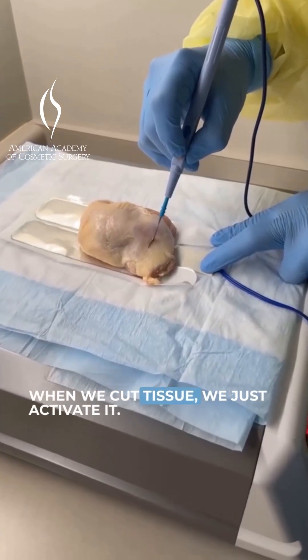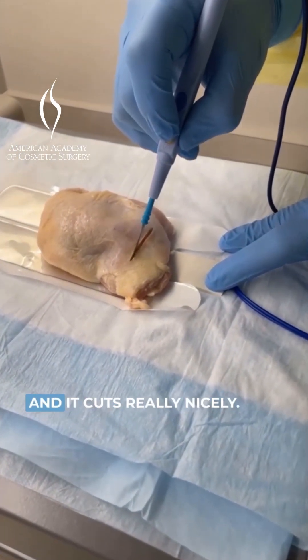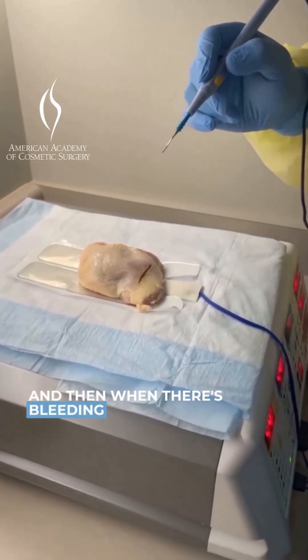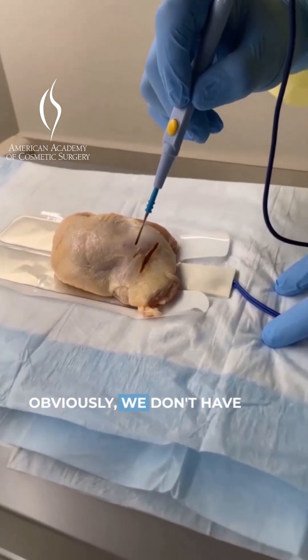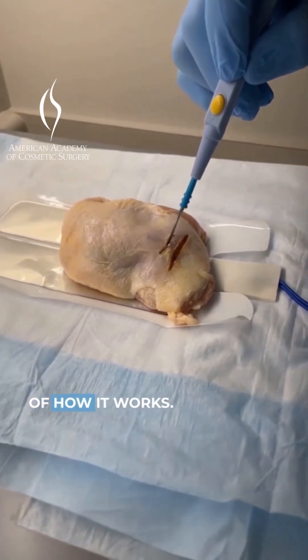When we cut tissue, we just activate it and there you go. You can see the tissue being cut and it cuts really nicely. And then when there's bleeding, you want to use coag. Obviously we don't have anything bleeding right now, but this is a demonstration of how it works.